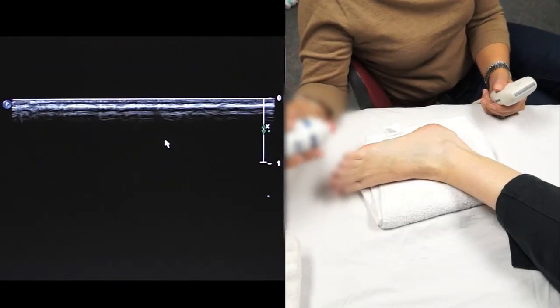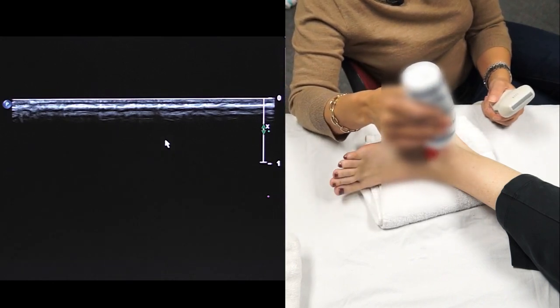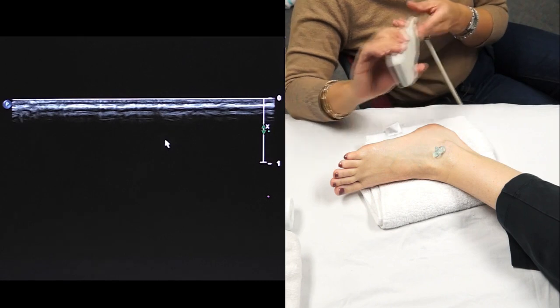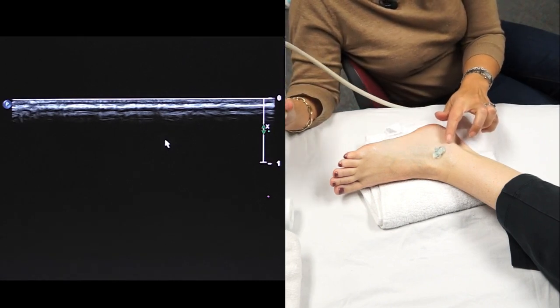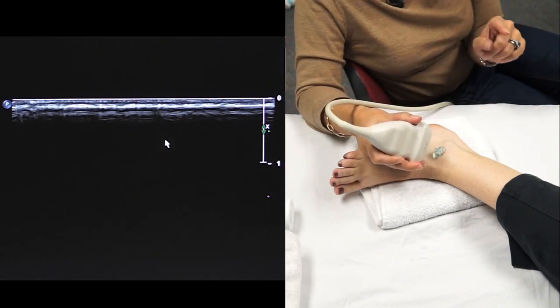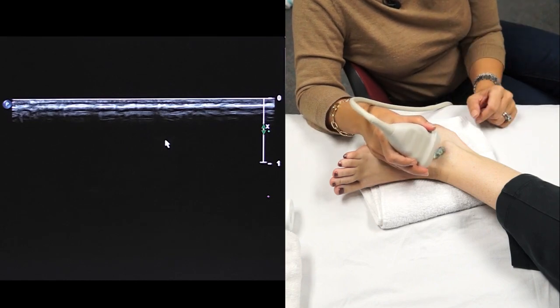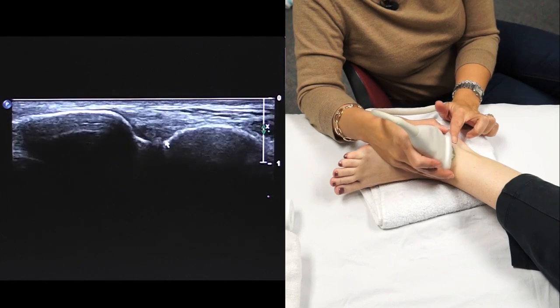Okay, moving on to the lateral ankle. We will look at the lateral ankle ligaments and also the peroneal tendons. So first you want to palpate for the lateral malleolus, and you can put your transducer in transverse plane with the marker pointing to your left, the patient's right, or to the 9 o'clock position, and you want it anterior to the lateral malleolus.